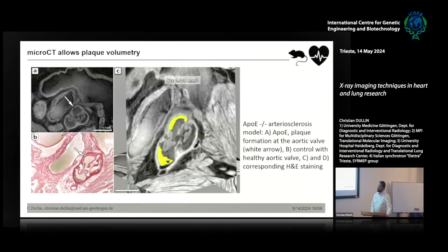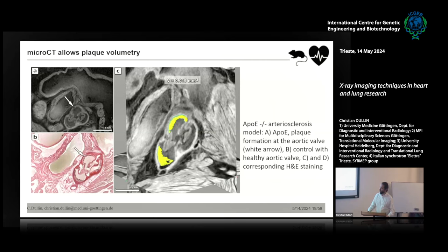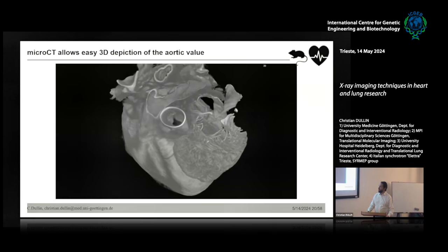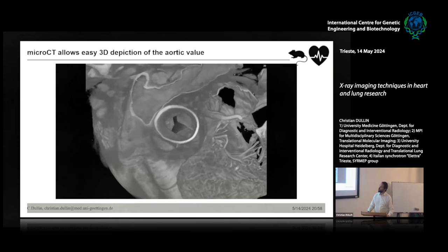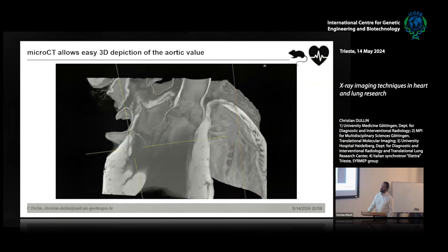One application where you really want 3D information is understanding the burden of aortic atherosclerotic plaques. In an APOE mouse model, you can easily segment the plaque formation and get a better idea of the plaque load in the mouse. With synchrotron data on a stained mouse heart, you can scan the entire thing and easily slice through it to analyze the valves.